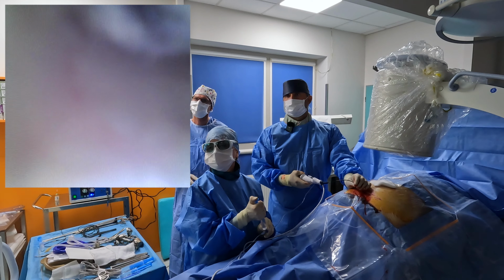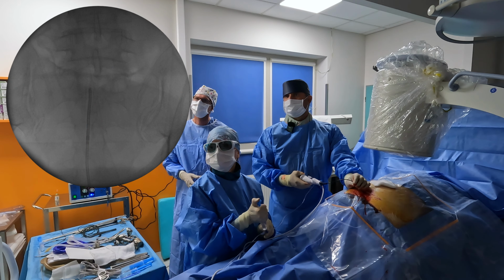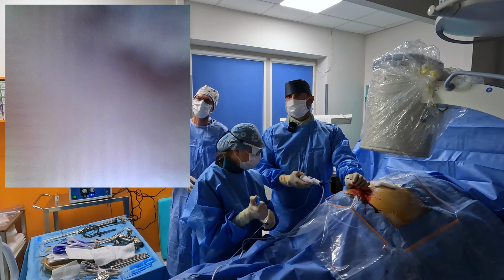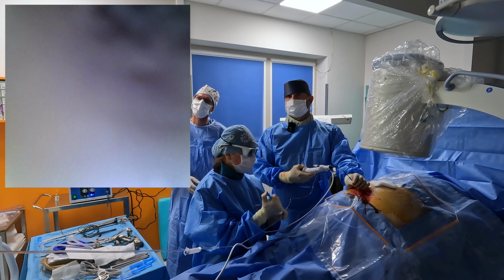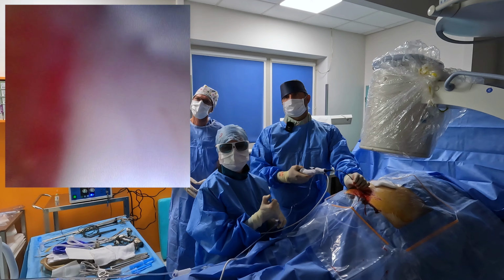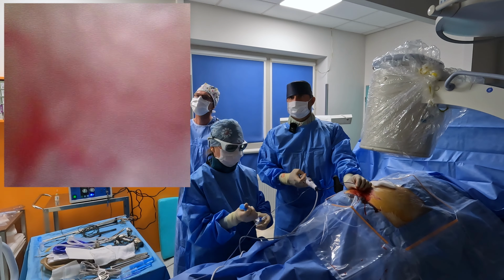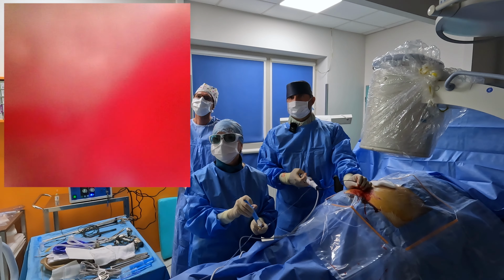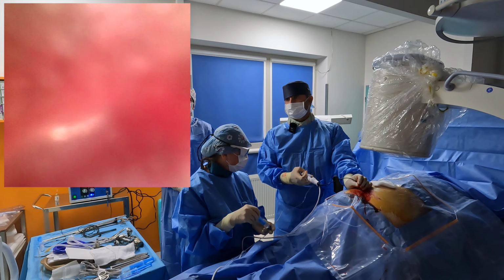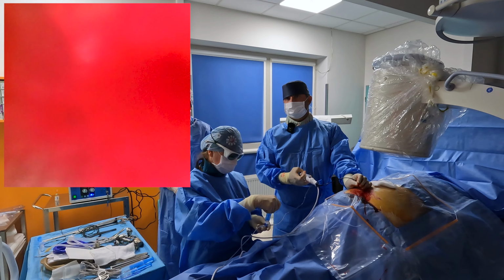We carry on. I'm now inside the sacral canal and slowly coming to the level of a little bit of adhesions, to the level of the S1 nerve, which can be the problem because of clinical symptoms. I have some kind of hypervascularization with the epidural fat here. Checking here, epidural fat, which is a good sign. And it's a little bit of inflammation and a little bit of bleeding here. But it also doesn't look like a significant problem. And as I said, we are still in a posterior epidural space.